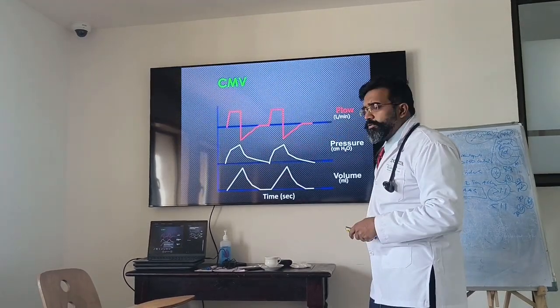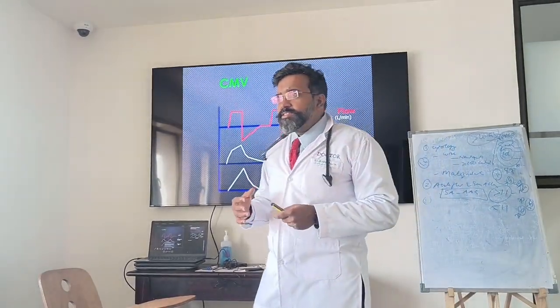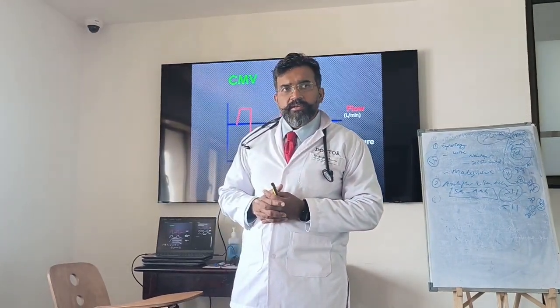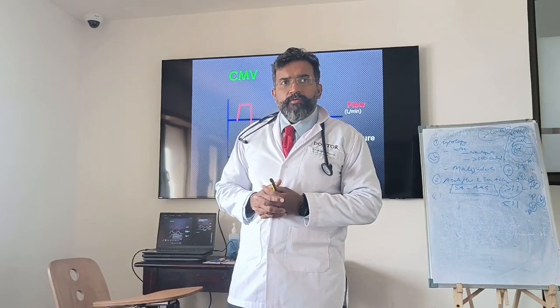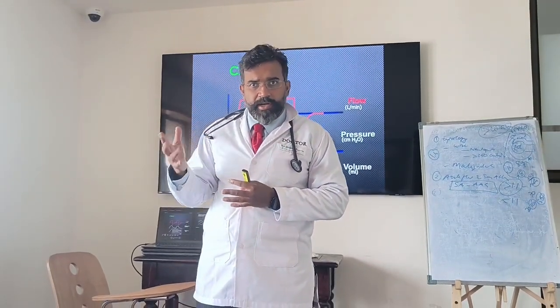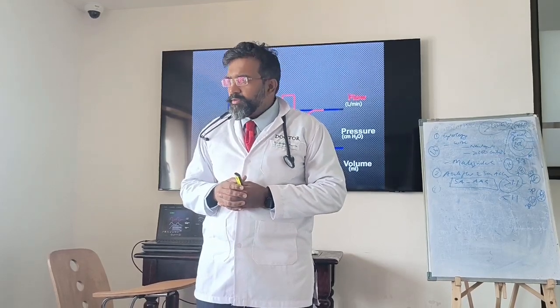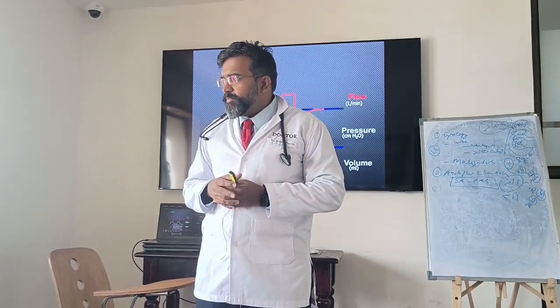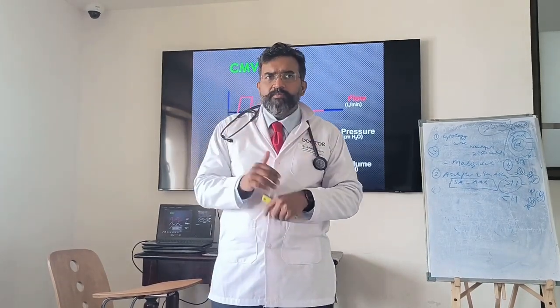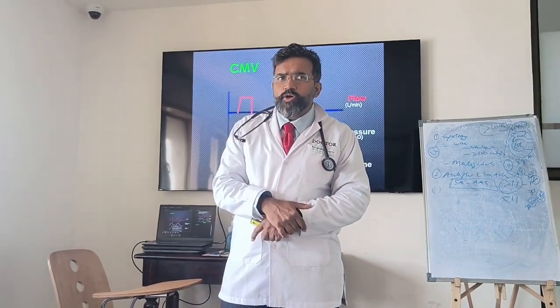Alright. Now, what was trigger? Trigger is the initiation of a breath. What causes the breath to start is the meaning of trigger. Simple? What causes the breath to start is the trigger. So, can you think of some triggers and tell me in your ventilation what could be a trigger?